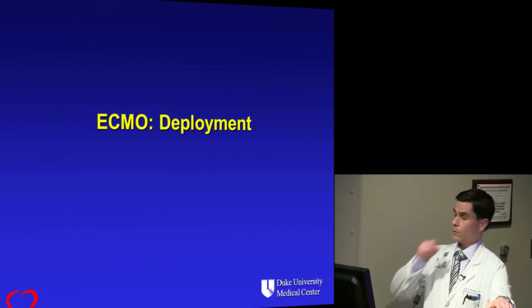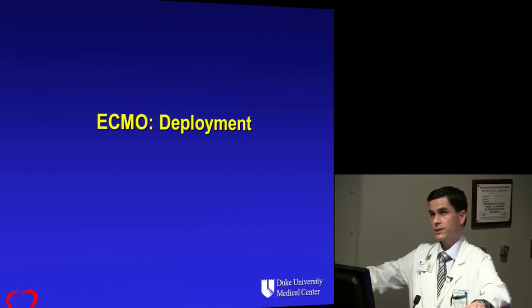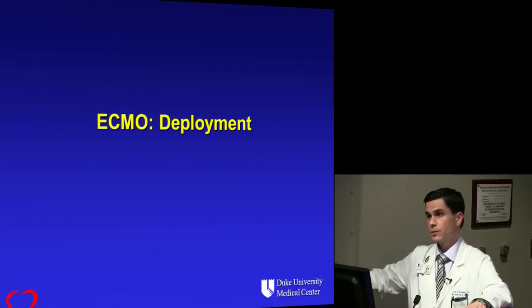So deployment. We know from the pediatric data that improvement in efficiency and timing of deployment makes a difference in these patients. We have some data from other centers like Columbia that also supports this.